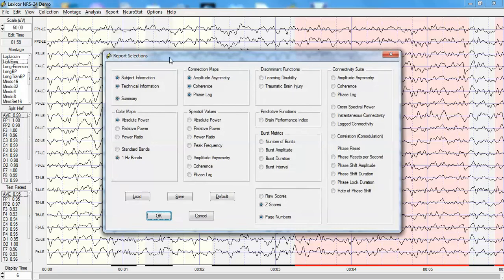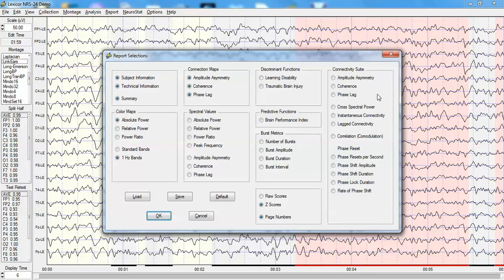This is a report selection in which there's a variety of different analyses that can be done, including burst metrics and connectivity suite analyses such as phase shift duration or phase lock duration, absolute power in one hertz bands, and connectivity as measured by coherence and phase.